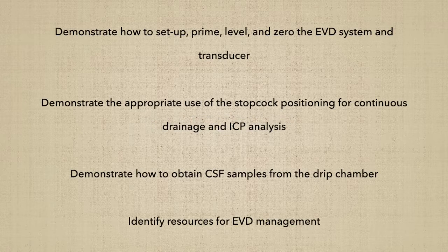The objective of this video is to demonstrate how to set up, prime, level, and zero the EVD system and transducer; demonstrate the appropriate use of the stopcock positioning for continuous drainage and ICP analysis; demonstrate how to obtain CSF samples from the drip chamber; and to identify resources for EVD management and setup.